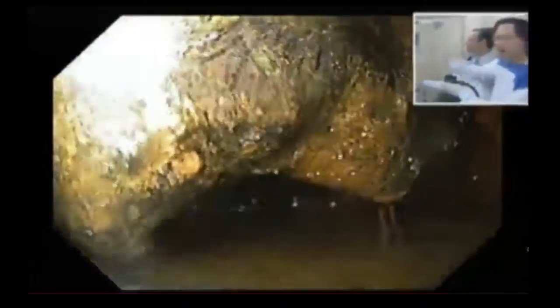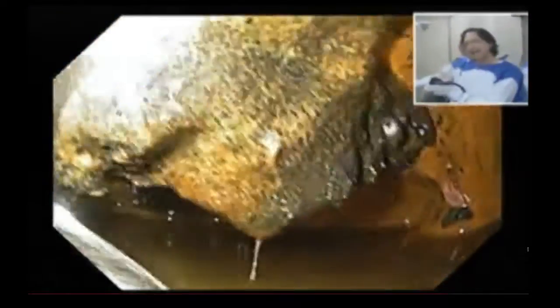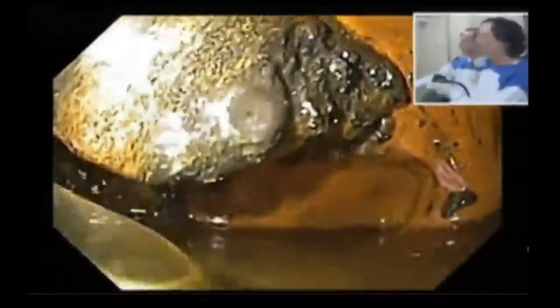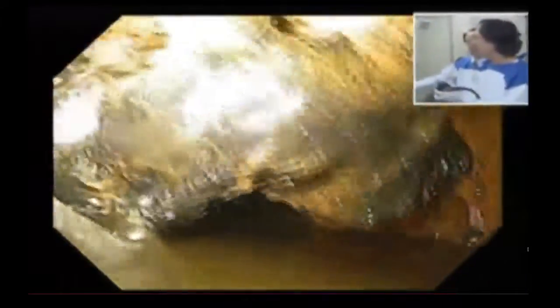And then at the very end, I put hydrogen peroxide in. 3% hydrogen peroxide, diluted 50-50, and I put 20 milliliters inside. And then you see it all bubble up, and that keeps the cyst nice and clean. The other thing I do is I tell the patient to not take any PPI for 1 month. No PPI, because I want to keep this sterile. I want the stomach acid to maintain a sterile environment. And finally, I also put the patient on antibiotics for at least 1 week.